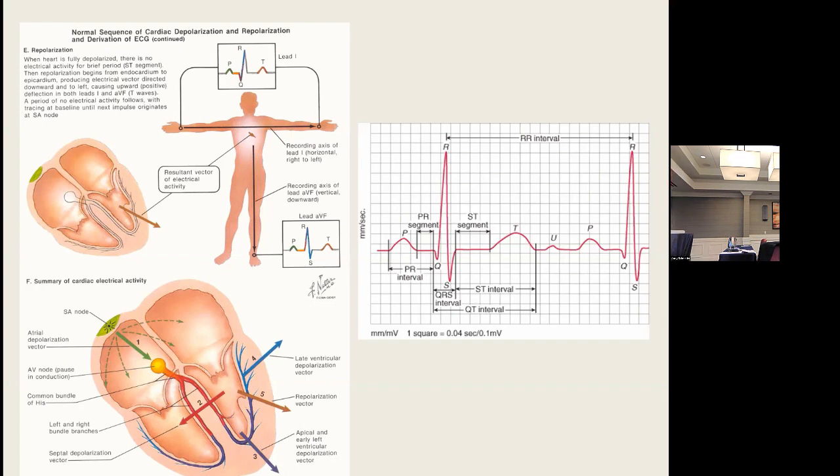And the QT interval, the beginning of the Q to the end of the T wave, because we want to know that the time from the onset of depolarization to the end of repolarization has provided an adequate interval of time so that we don't overlap with the next beat. And that overlap can have disastrous consequences and set up arrhythmias like VTAC, VFib, and so on. So the clinically important intervals we're going to learn about, the first I of intervals, is PR, QRS, and QT.